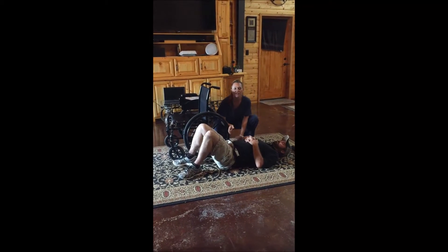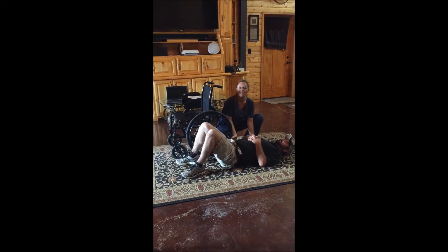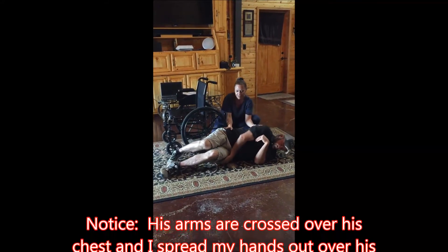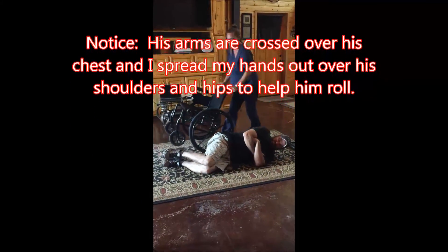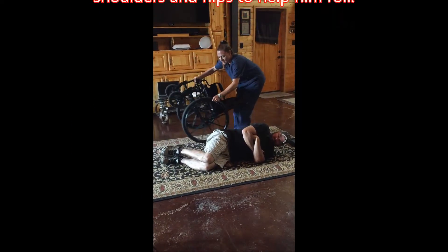Have the person who is on the floor roll onto their side. Next, lower the wheelchair and get it close to them.